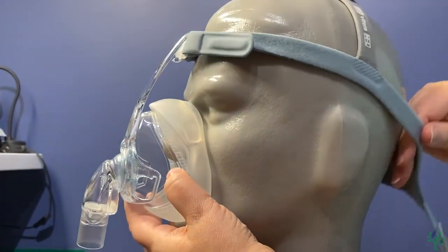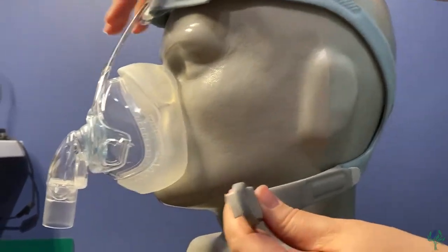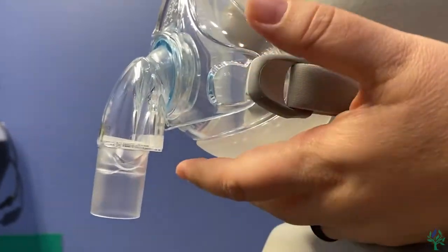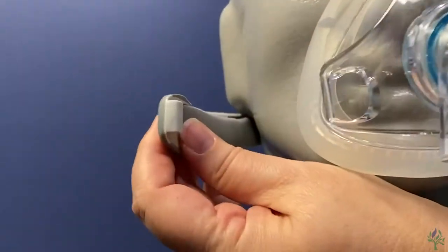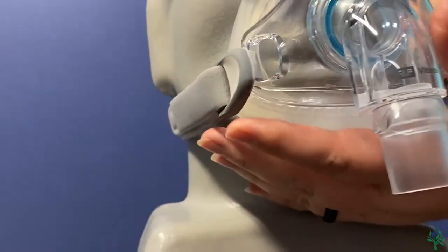Go ahead and pull the rest of the headgear up and over. You'll want to bring each one of these clips around and snap those into place on either side here.